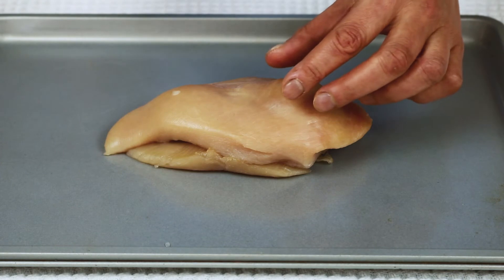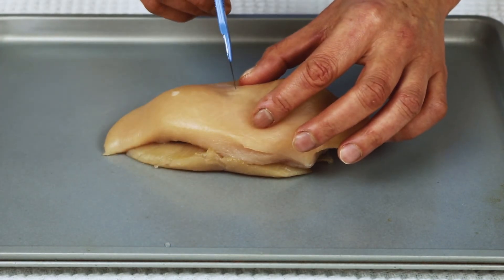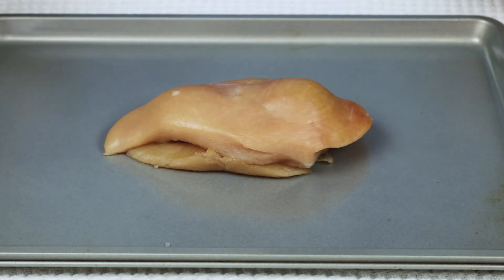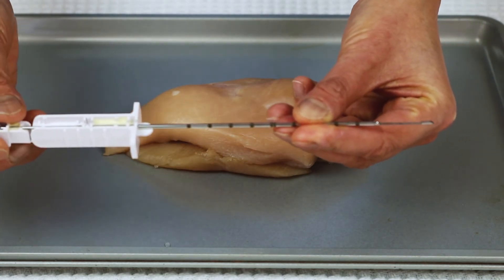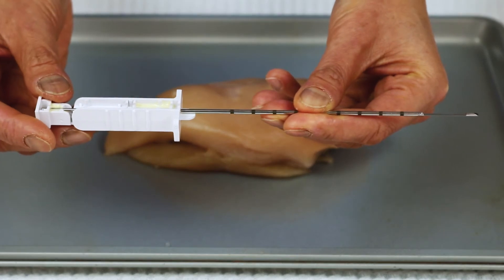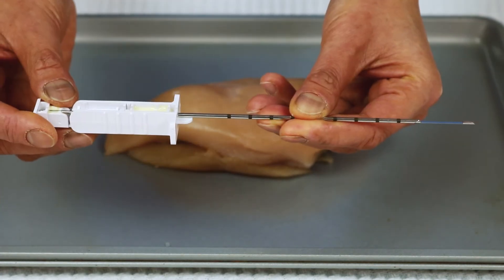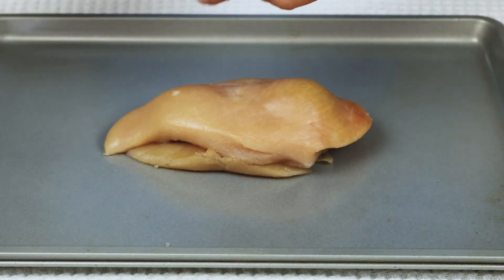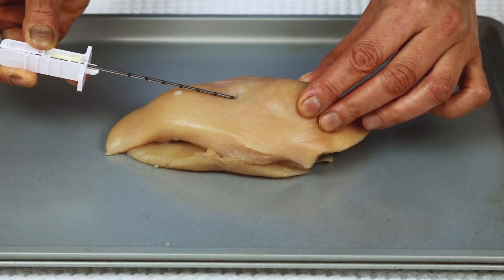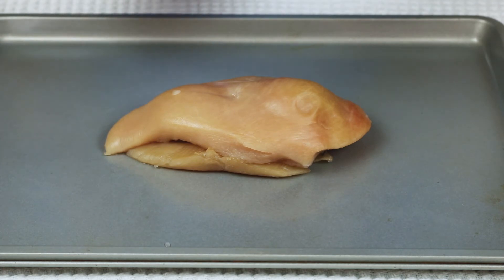Once that is done, we have to make a small nick in the skin in order to insert the trocar needle. I make a small incision here, and once that is done I use the trocar needle — which has a special tip to take a core biopsy — to actually do the biopsy. I'm doing this by hand; however, most of the time people will use an automatic gun that allows the needle to come in and out very quickly. I insert the needle into the mass, the inside comes out, the outside comes over it, and once we remove it we usually have a small piece.